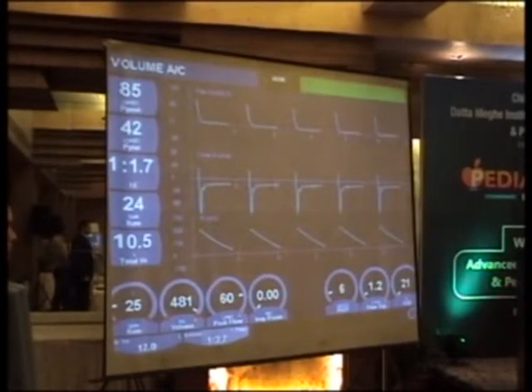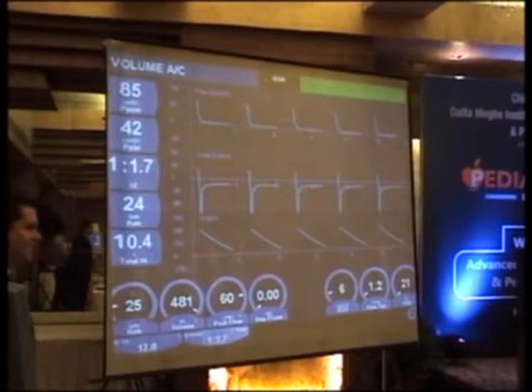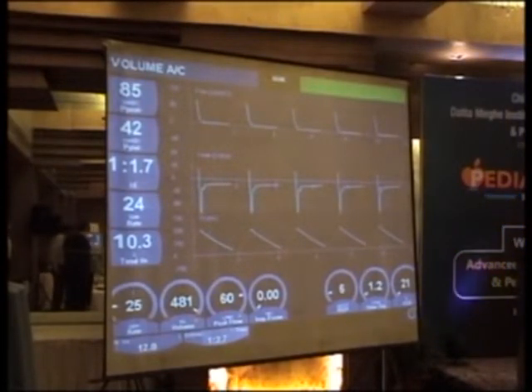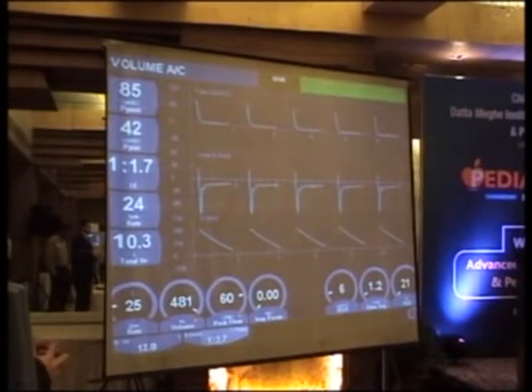Because I can tell you that regardless of what you can do with the ventilator, what that person is doing right now, through millions of years of evolution, is close to the most effective way that that person can breathe. The tidal volume, the rate, everything about that breathing pattern is designed to be as effective as it can be, and it's still not working. So when you put this patient on the ventilator, you're going to have to be very clever to do a better job than Mother Nature.